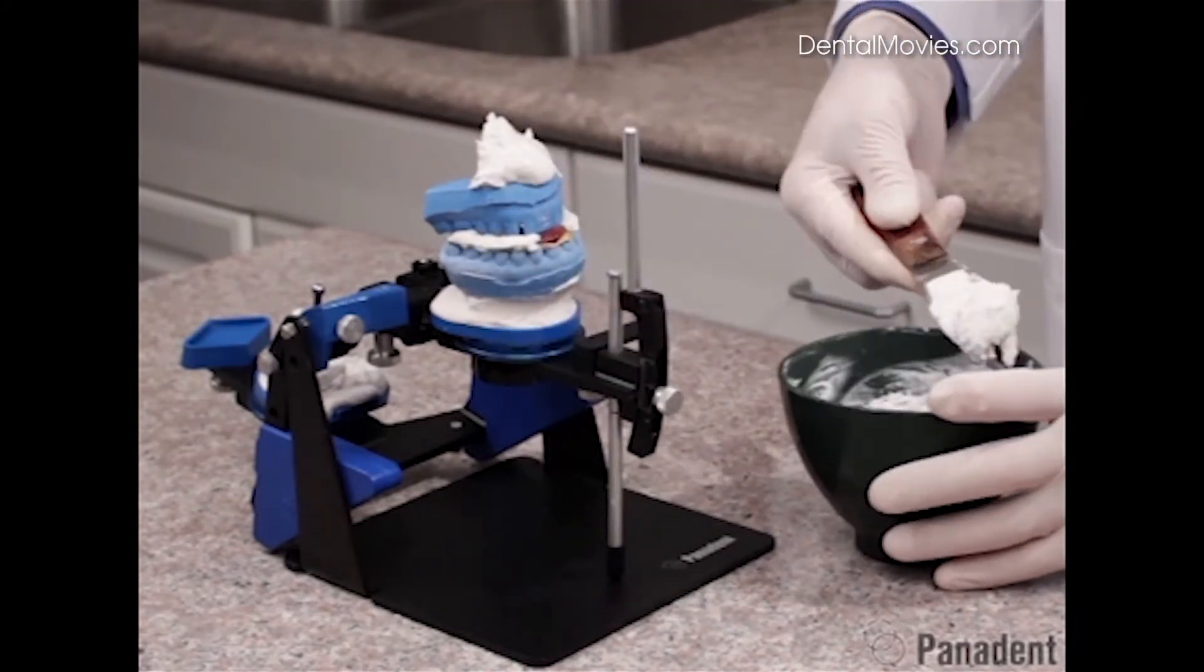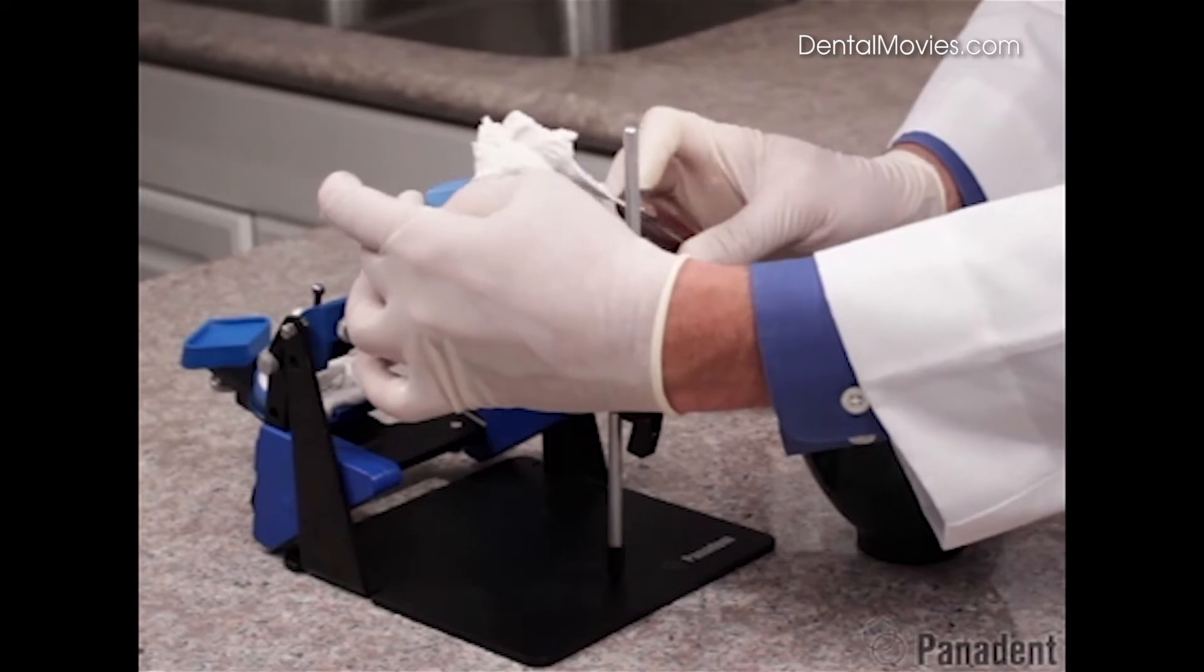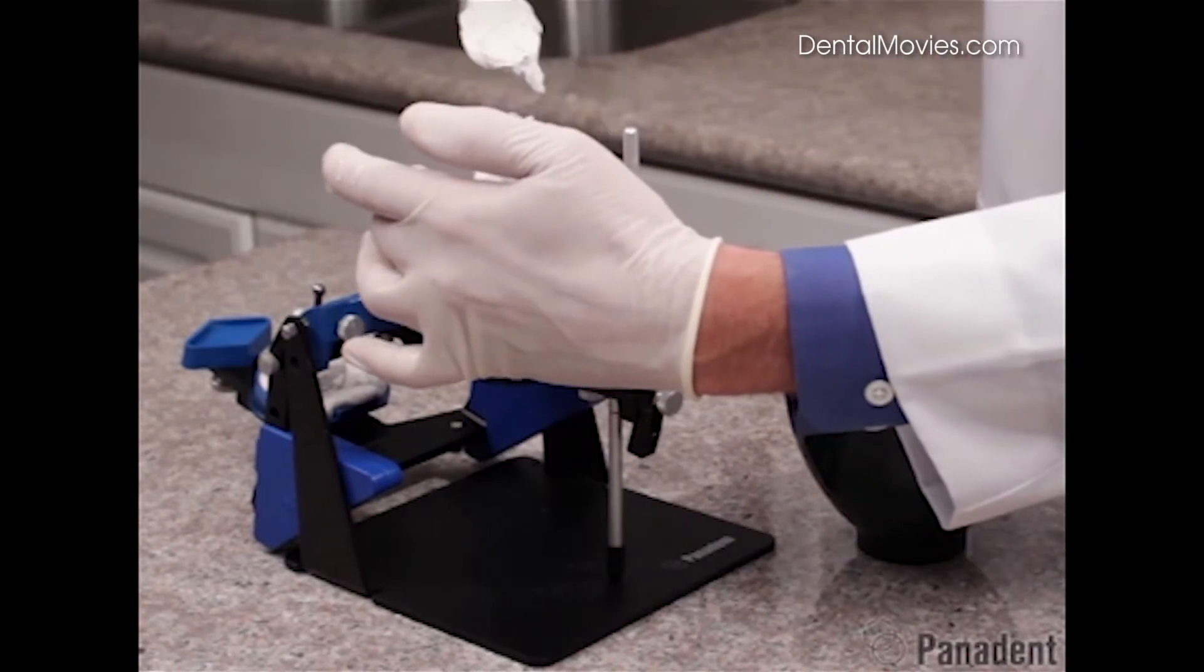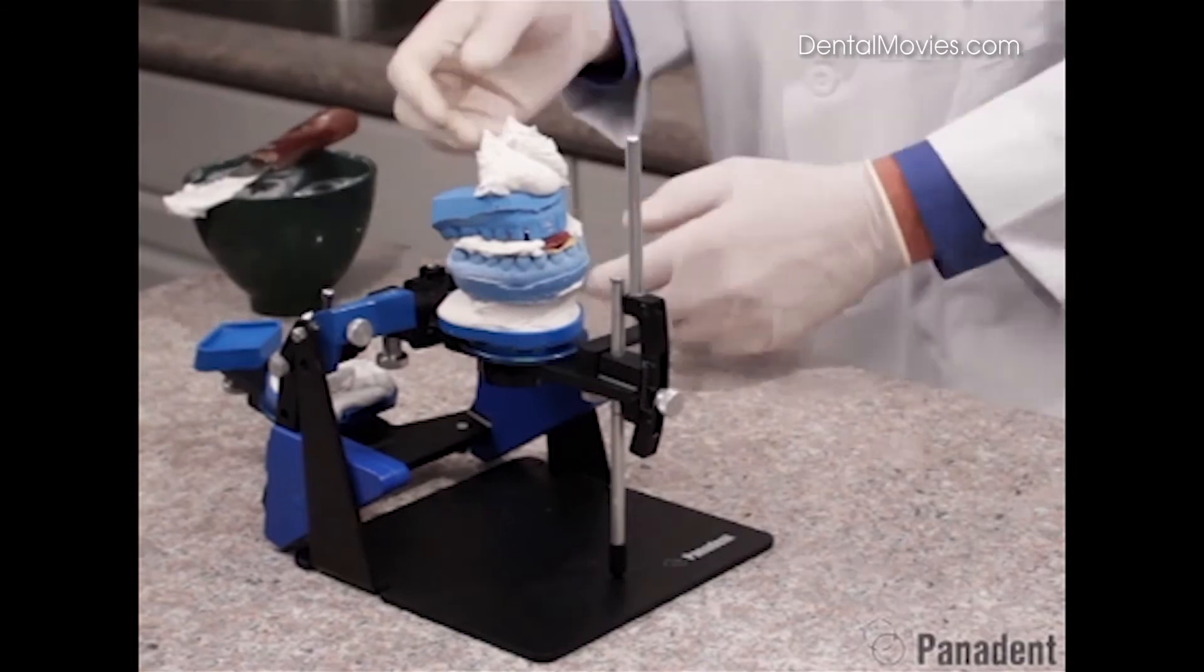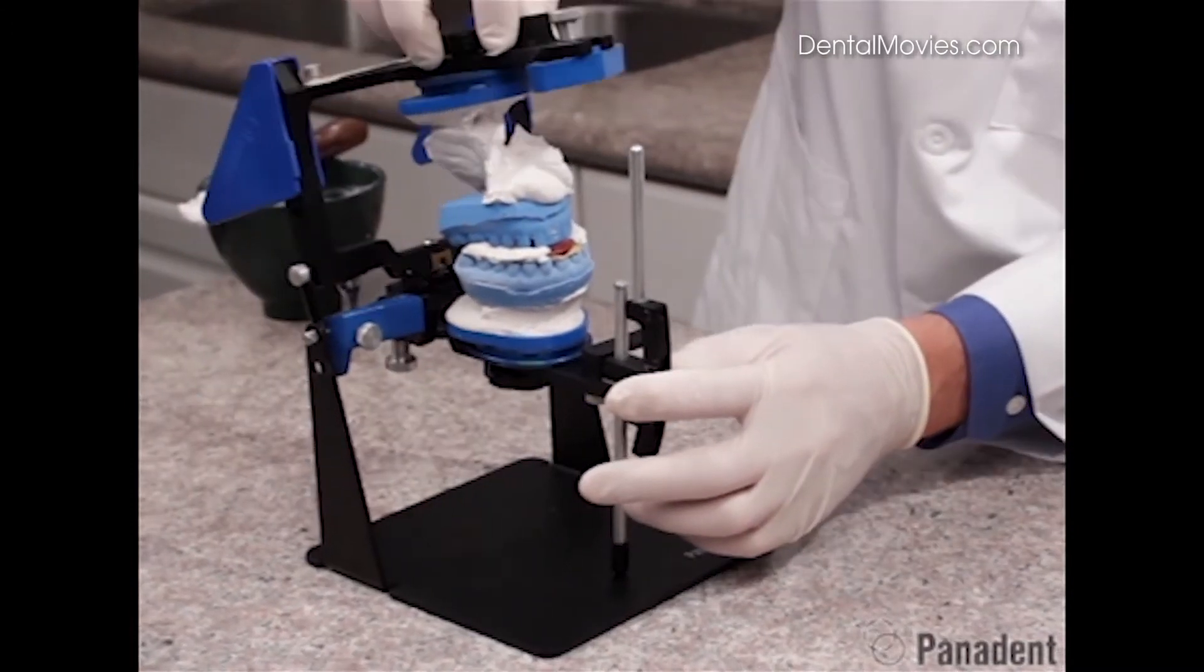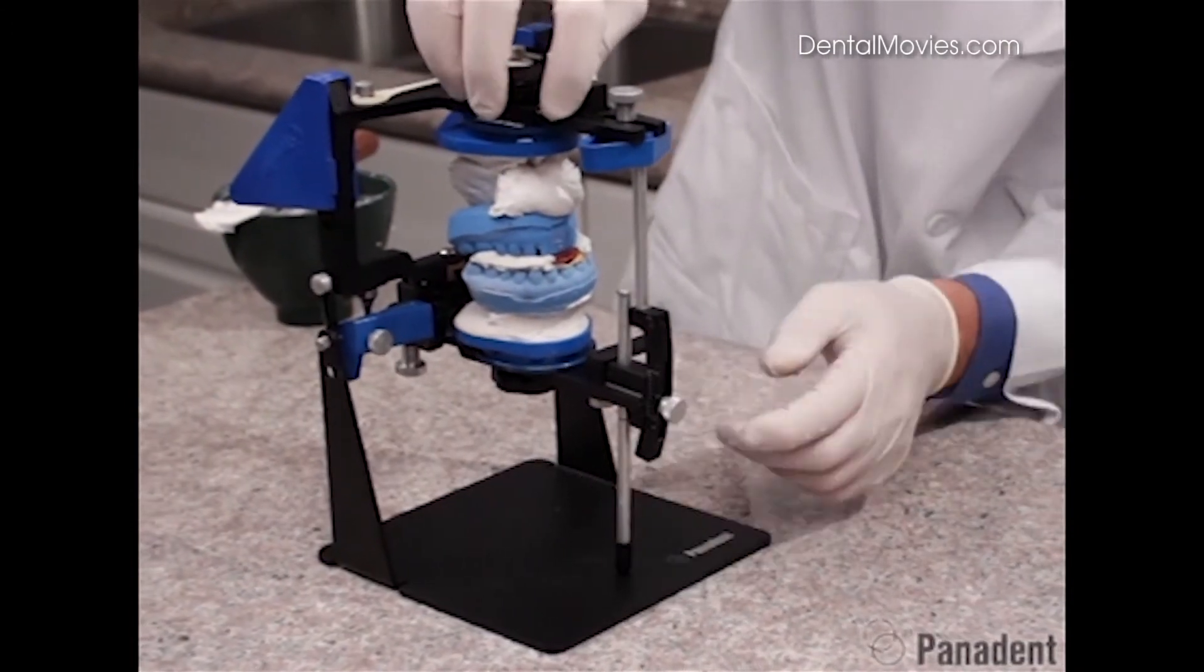So we'll add some plaster to that and then we'll add a little plaster to our model. Now all we need to do is just make a connection. So we'll swing this around, making a connection of the plaster to the mounting plate.